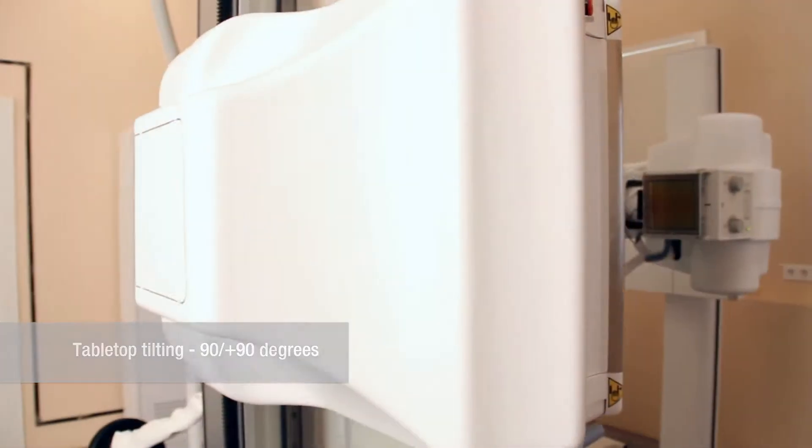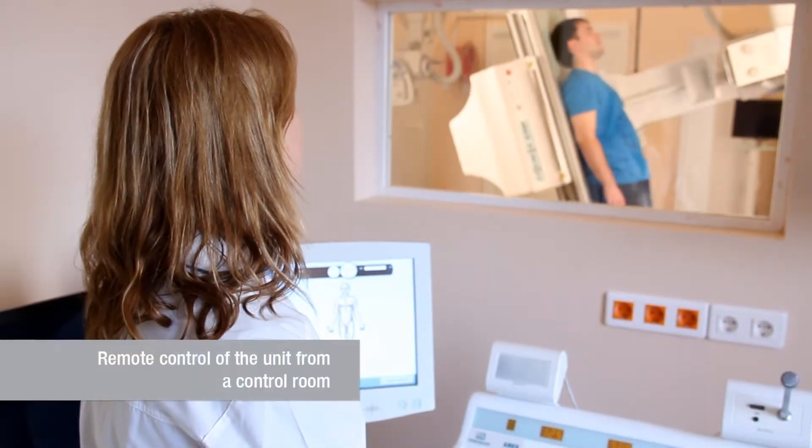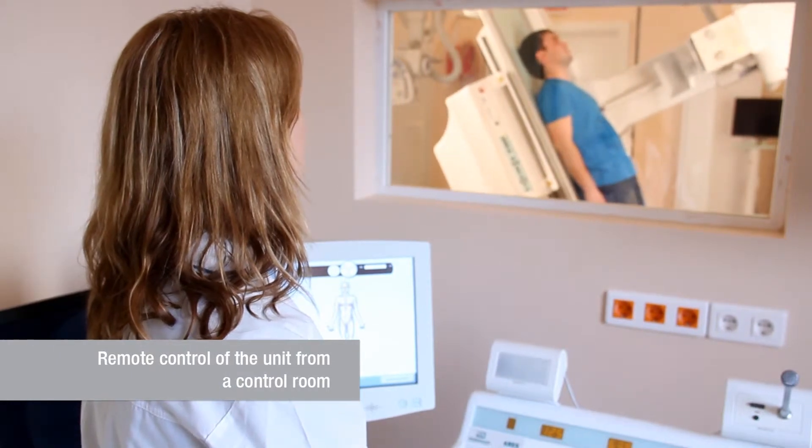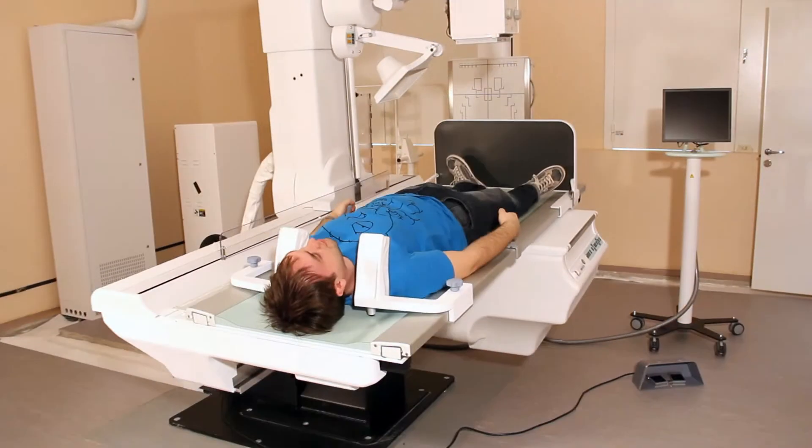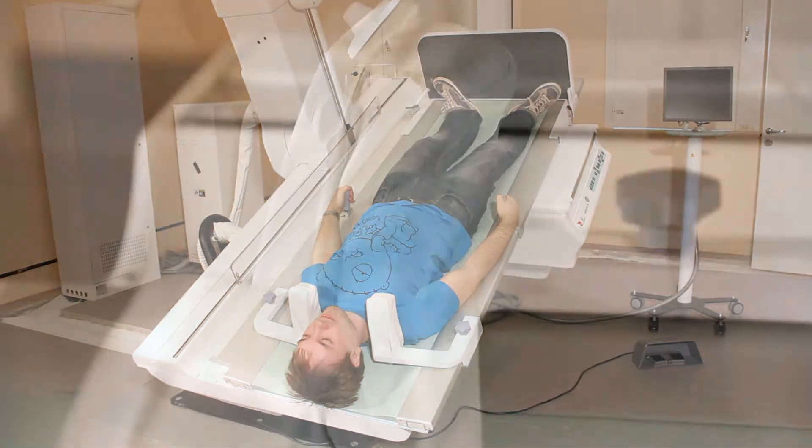The integrated video system producing images of the highest quality can be both analog and digital. When the table is brought into the Trendelenburg position, safety and comfort of a patient is provided by shoulder fixators and arm holders.